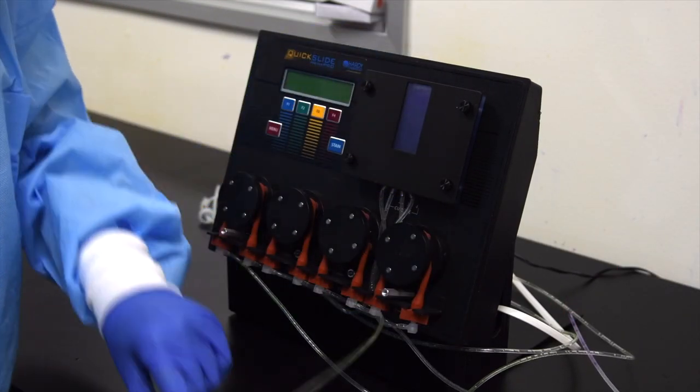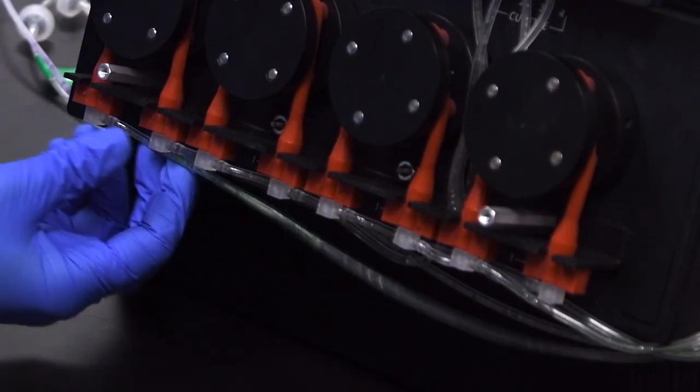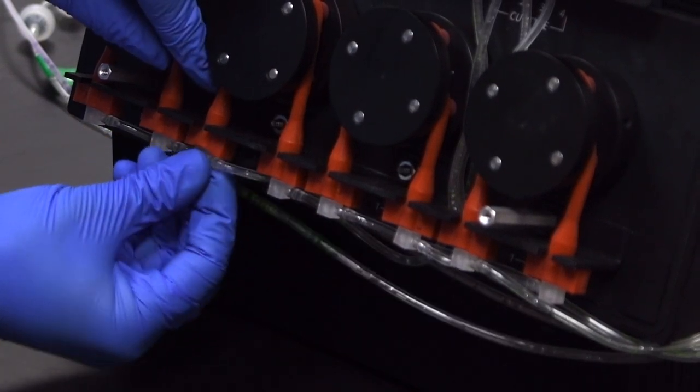Take the long end of the clear cannula tube and wrap it around the right side of the machine. Make sure the cannula elbows are tightly connected to the orange pump tubes.